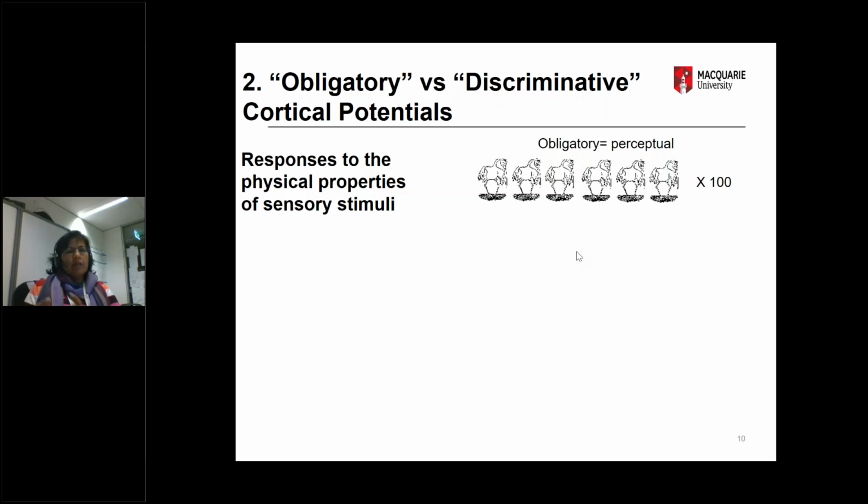But the background EEG, which envelopes this auditory or visual cortical response, is quite massive, often 10 times larger, in response to your muscle, everything you're seeing, everything you perceive, your somatosensory. All of that needs to be extracted. So in order for us to do that, we have to present the same signal or stimulus at least 100 times for cortical auditory evoked potentials. And then eventually we average them and we get a response. But this is an obligatory response, which is a response to the physical property of these visual stimuli or the whistles that you would hear.